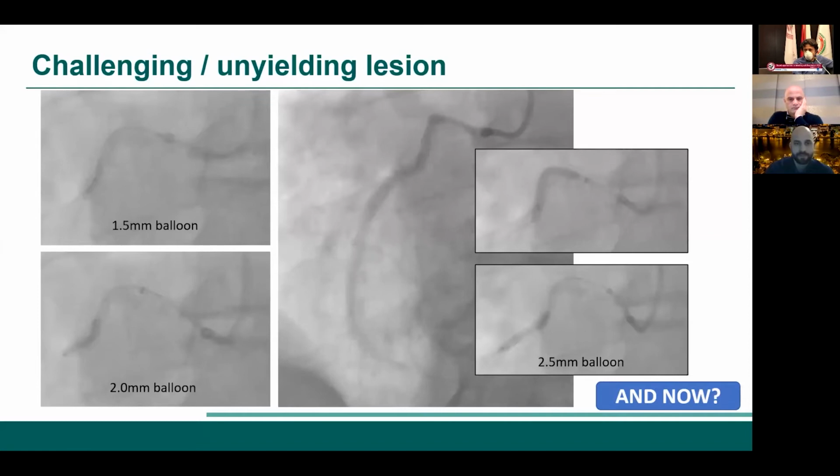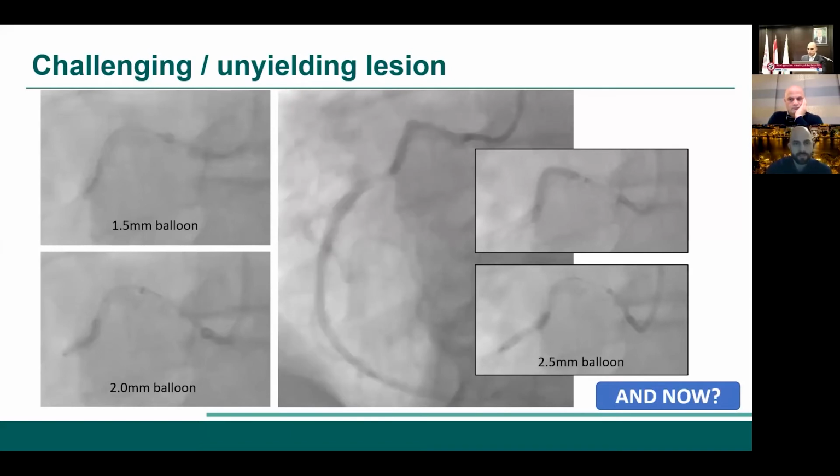Excellent, great comments. And we're thinking along these lines, thinking about the tortuosity and the challenges, but also we had the guide extender. Yes, we didn't have a 7 French, but we can still do stuff with sticks. I'm very biased in interventional cardiology. I know we're working today in Lebanon with a lot of resource restrictions, but I'm a big fan of imaging, specifically intracoronary imaging.